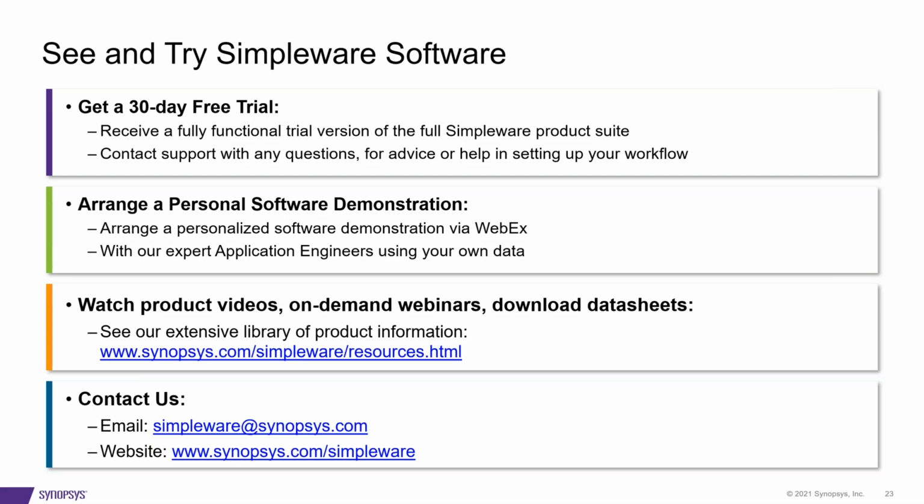Yeah, I think it's a really quick one. It's all included as part of the Simpleware ScanIP Medical license. So no additional modules. It's all included. You just need the one, and depending on your workflows, you can add in more. If you're doing some more complicated prints, we do have an extended surface tools module called the CAD module, and you can do a lot more complex operations to build your prints.